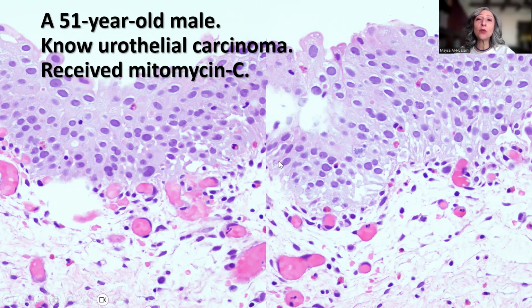And the first thing that would come to mind once you see this on low power or intermediate power magnification is, is this dysplasia, is this carcinoma in situ, because there is variation in the nuclear size and appearance. There is loss of polarity where some of the nuclei change their position while the cells are reaching into the surface epithelium, into the umbrella cell layer. There is some variation in the nuclear sizes and shape, as well as mitotic figures here and there.